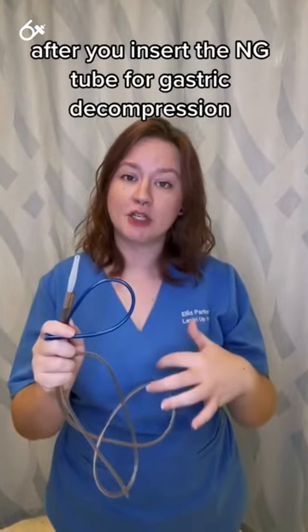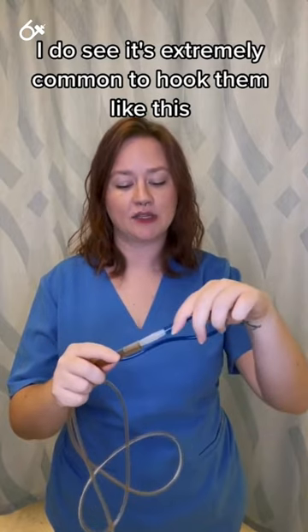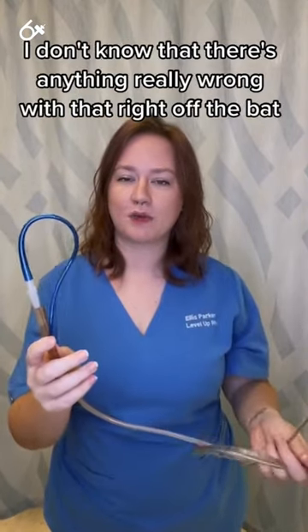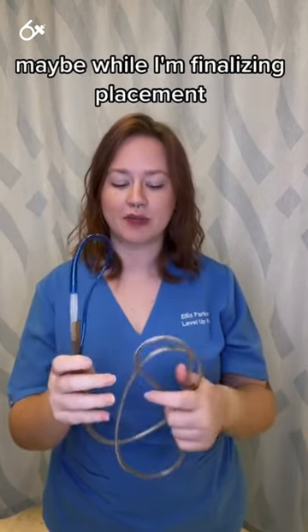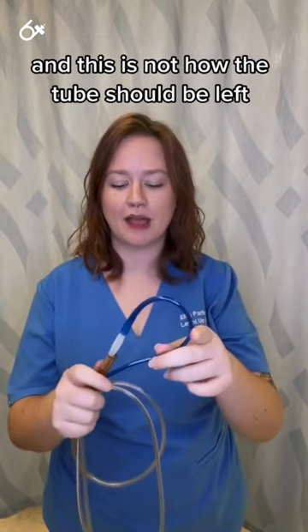After you insert the NG tube for gastric decompression, it is extremely common to hook them like this. There isn't anything really wrong with that right off the bat, maybe while finalizing placement, but this is not best practice and this is not how the tube should be left.